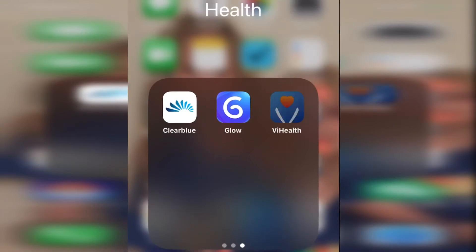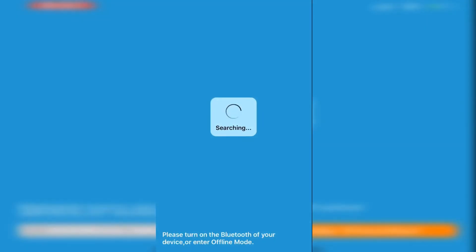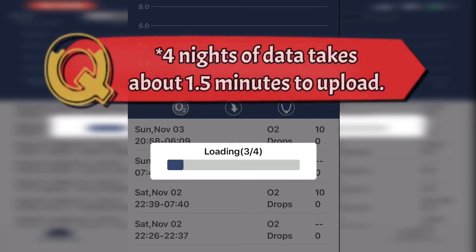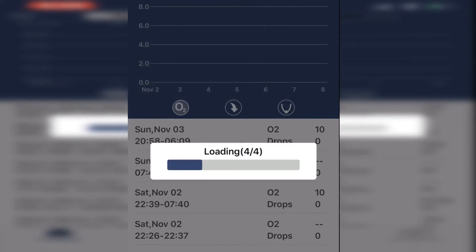Time to upload. Find the app, wake the ring up, and sync the data. It can take up to four data sets at a time — after that it rewrites over old sets. In real time it takes about a minute and a half to upload the four data sets. Once it's done you'll have access to all of your files and all of your old files.